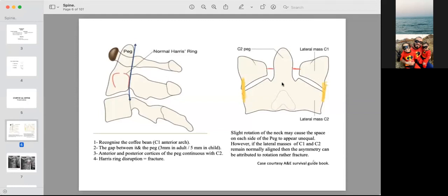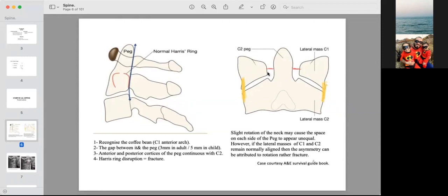On the frontal view of C1 and C2, you can see the lateral masses of C1 and the dens. The lateral line between the lateral mass of C1 and the lateral part of C2 should be aligned with no steps. The distance between the lateral masses of C1 and the dens should be approximately equal on both sides.